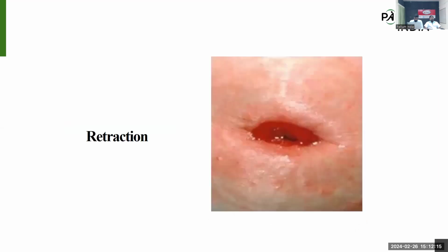So this one is the retraction. You already saw the normal stoma and stomal prolapse, but here retraction means the stoma is inverted inside. The normal stomal site is totally inverted. So here, on two sides of the stomal region some gaps are there. We cannot use the normal colostomy bag here, because in a normal colostomy bag the base plate or the wafer region is flat.